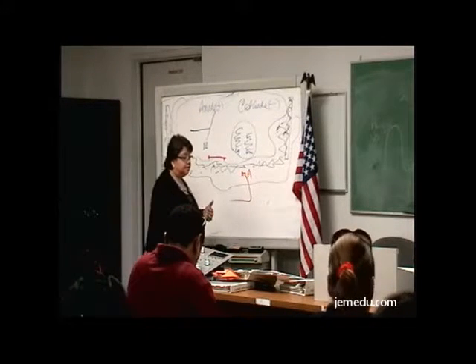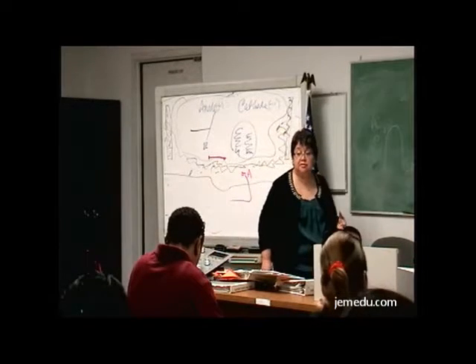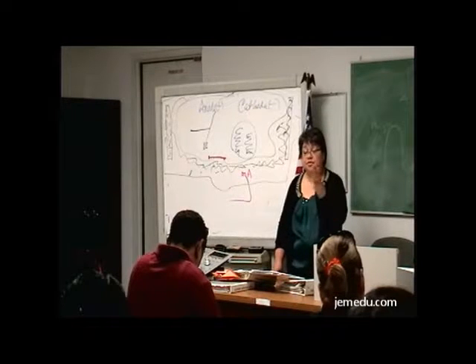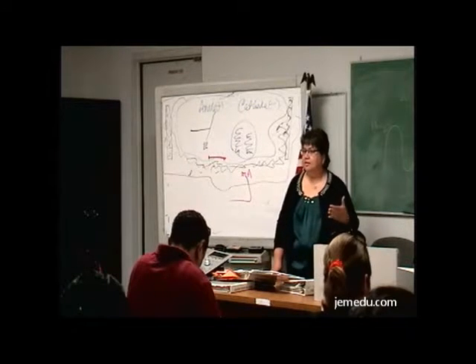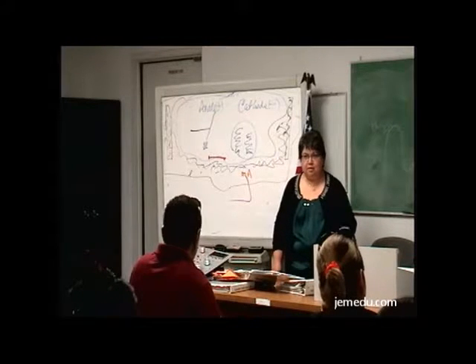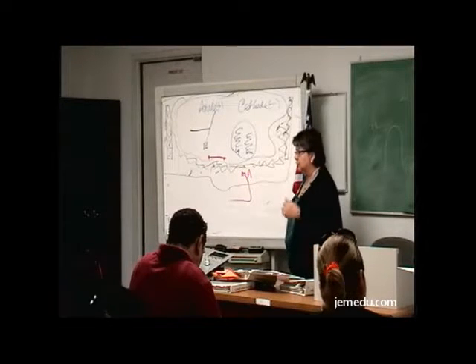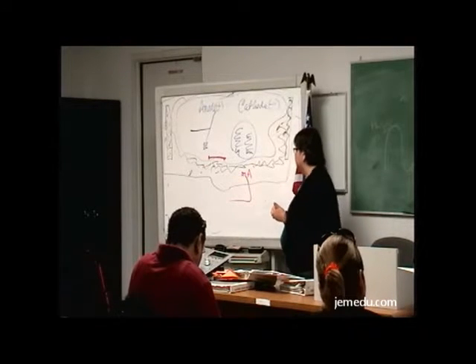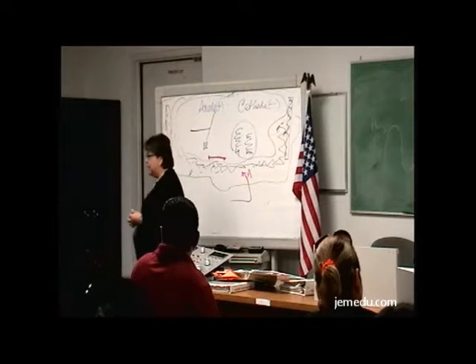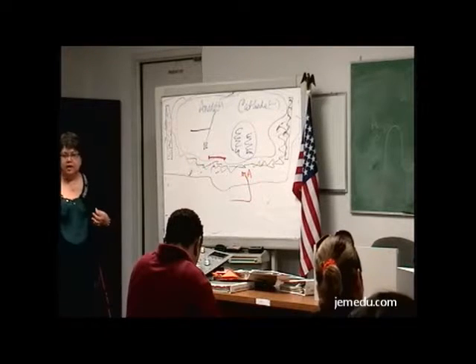All right, the second thing I'm going to need to do is move those electrons, or speed those electrons, specifically across from one side of the tube to the other. So I'm going to need something that moves things quickly or slowly, and that would be what? KVP. So we're going to move them with KVP. So we're going to get our source of electrons from milliamperage. We're going to speed our electrons, that's with KVP. And then we have to do something else to those electrons in order to get X-ray.